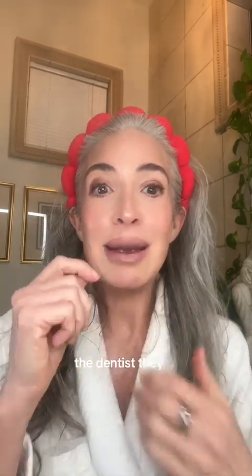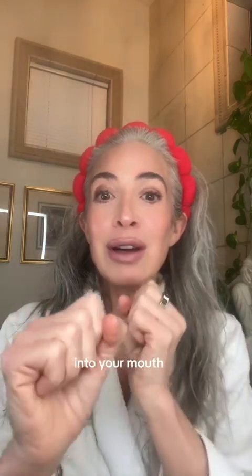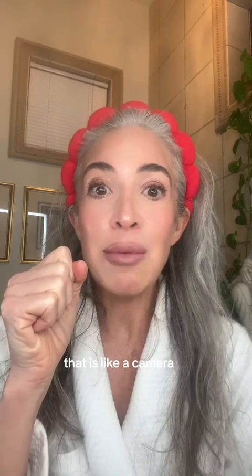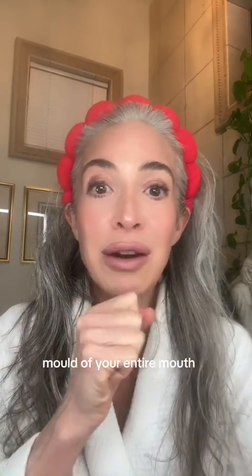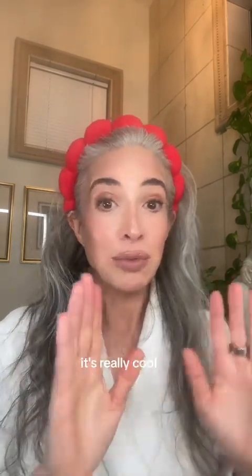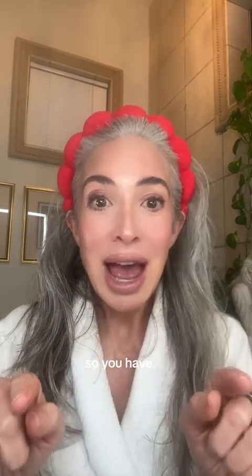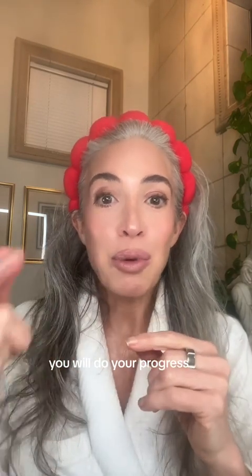So what we did is, when I was at the dentist, I mentioned this in another video, they stick this long stick into your mouth that is like a camera, like a 3D or a 5D, and they take a mold of your entire mouth and your teeth. They send that off to a lab, and then they create this program for you. It's really cool because it's an app.